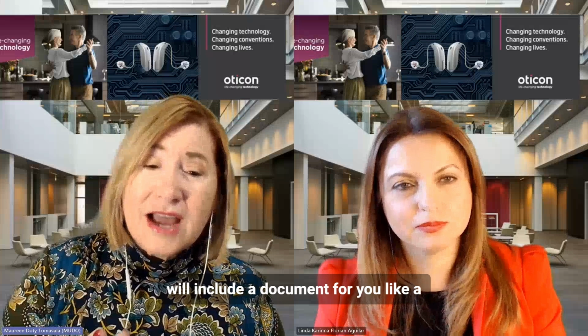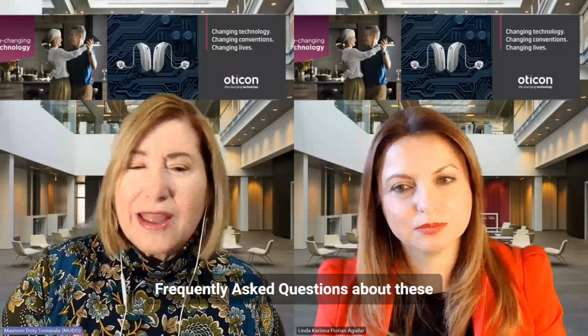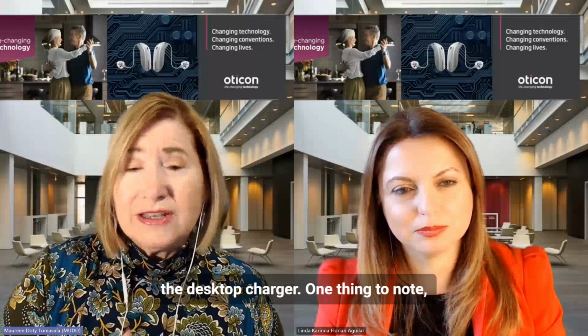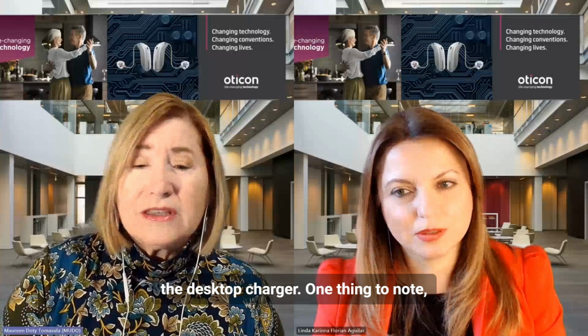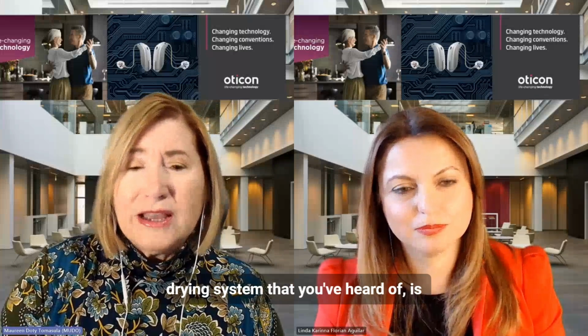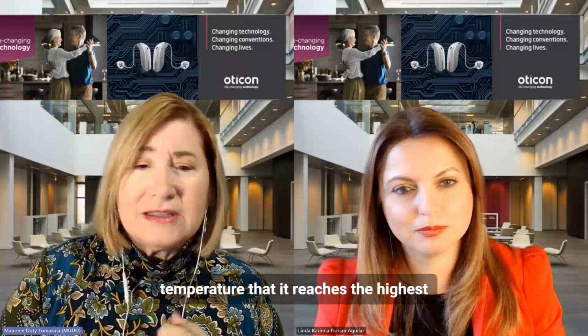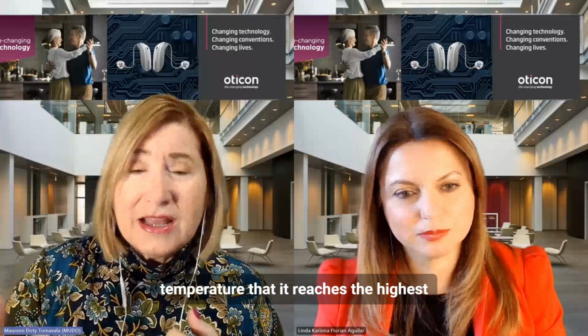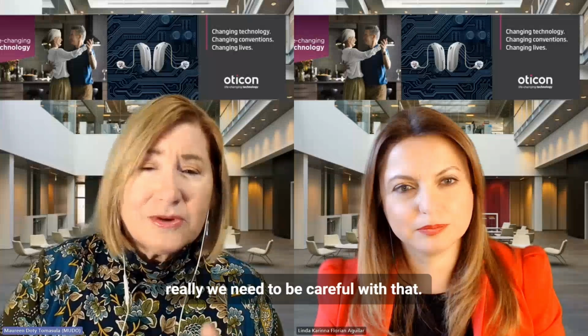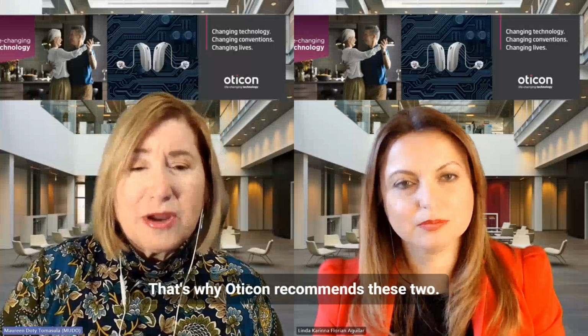And I will include a document for you, like frequently asked questions about these 2 different kinds of drying systems that you can use with the smart charger or the desktop charger. One thing to note, if you're thinking about another kind of drying system that you've heard of, is that we always want to make sure that the temperature it reaches, the highest heat level, and the length of time are really something we need to be careful with. That's why Oticon recommends these 2.